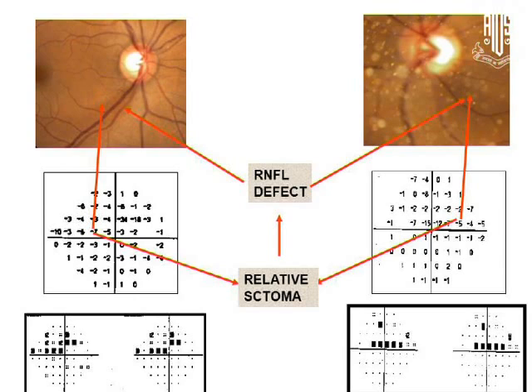Here both are early cases, but if you observe carefully, in one case it is almost coming towards the center. The progression is towards the fixation. In the other, the progression is not towards it; you see the retinal sensitivity is good, 5 and 3. Here the loss is -15 and -12, whereas there the loss is -5 and -3.